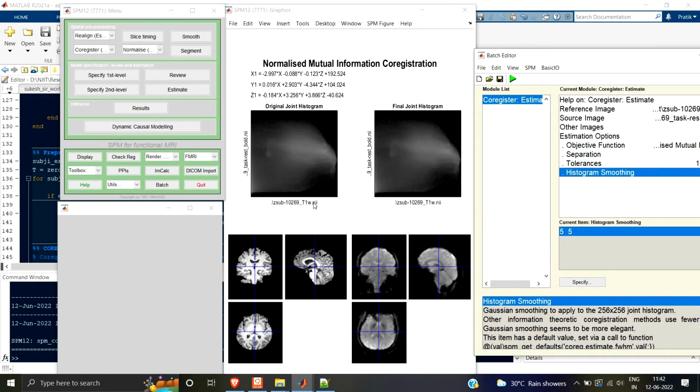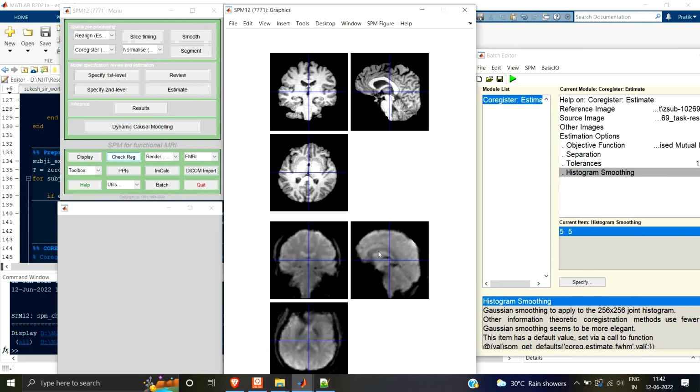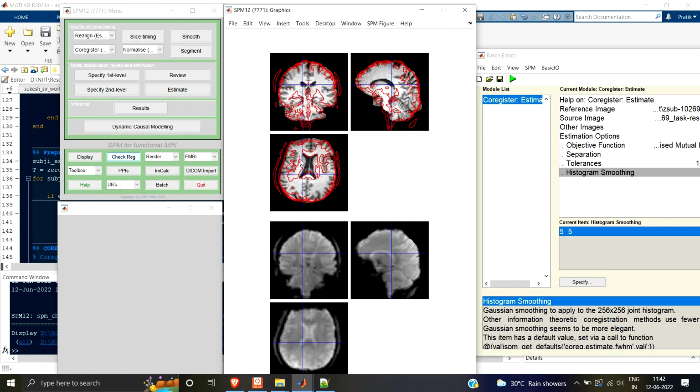Okay, so it has done the co-registration. You can see the output over here. Now let us again just check reg. Okay, now you can see this is a little better. You can see that these are aligned properly as compared to the one that was earlier. You can see this is better now. Okay, and now you don't need to reorient.